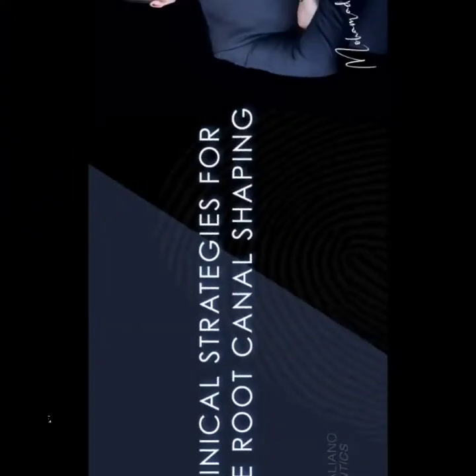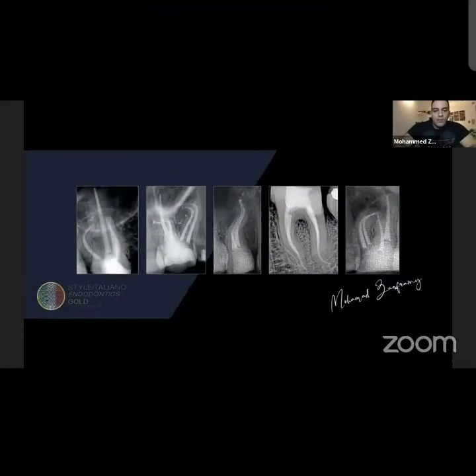So today I will describe to you how to safely shape the root canal and how to reach the apex and avoid many errors that could happen, like instrument separation, ledge, perforations. But no one can deny that all of us are happy with these shapes when you end your obturation or your treatment and you find you were able to maintain the curvature, you reached safely to the apex, you have 3D filling.